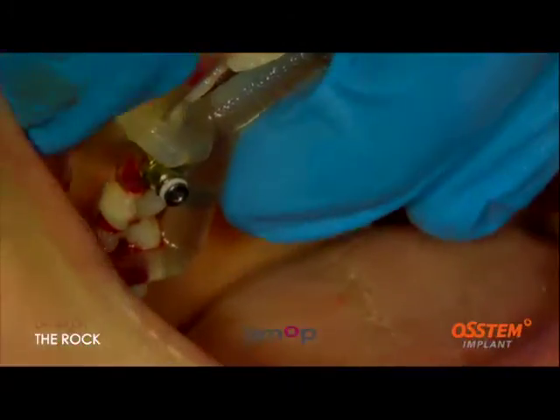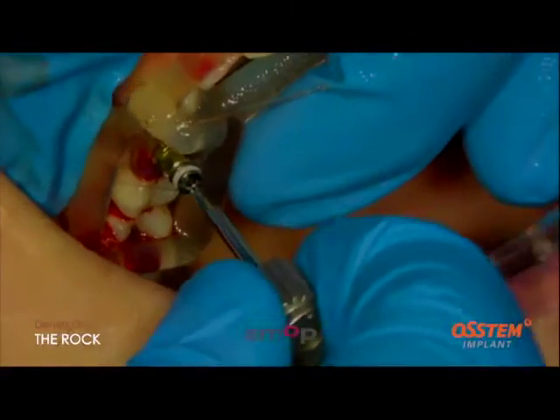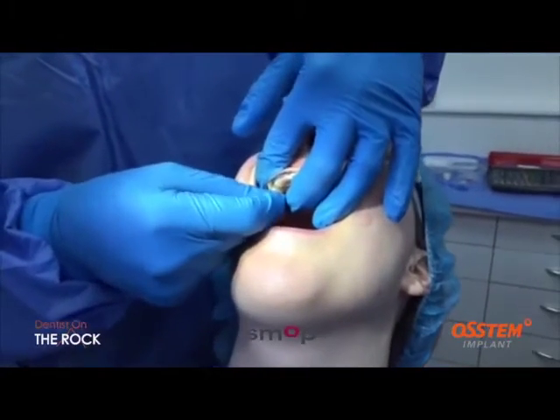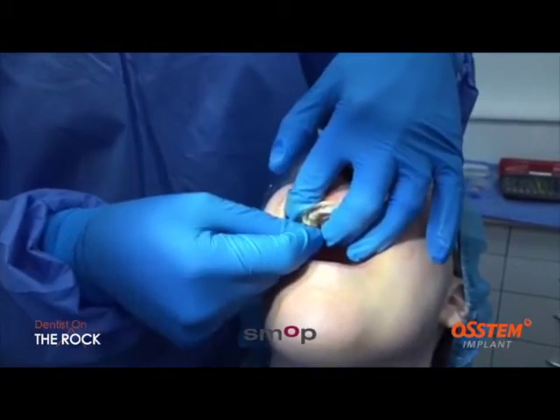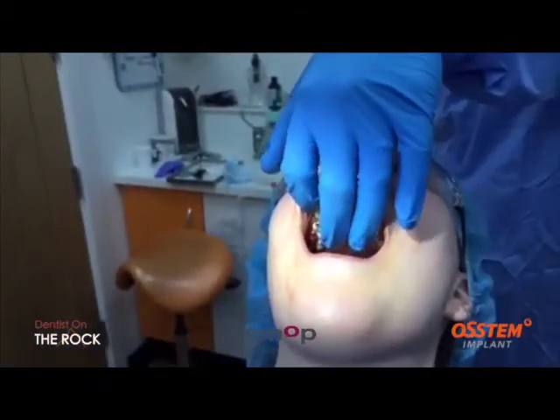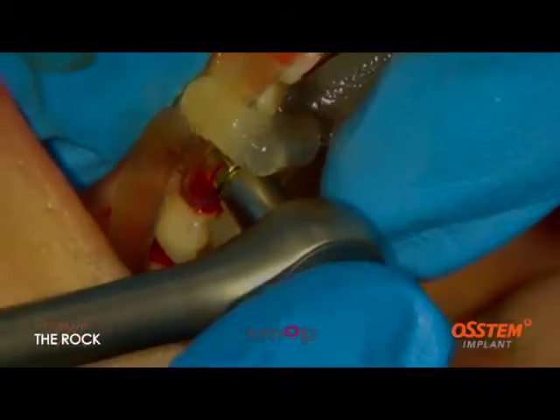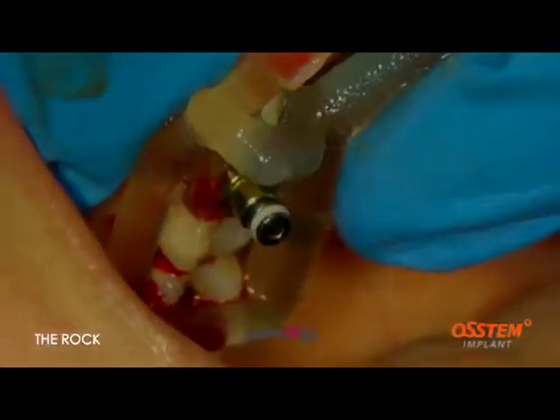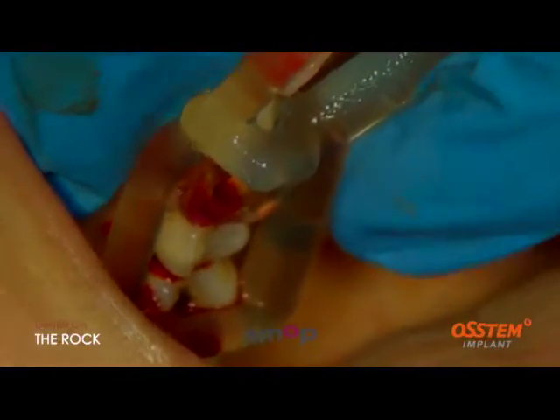I'll take everything off. And then we unscrew. Now sometimes it's a little bit tight in there, that's because of the accuracy. I'll just wiggle it a little bit. That doesn't want to go, and what I'll do is swap the torque wrench round with it unscrewed and just ever so gently pop it off, taking it the other direction. It shouldn't unscrew the implant because I've not engaged the implant with the screw, but what I should do is loosen that. And there you go, that's the implant in.